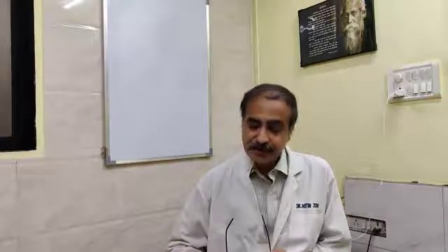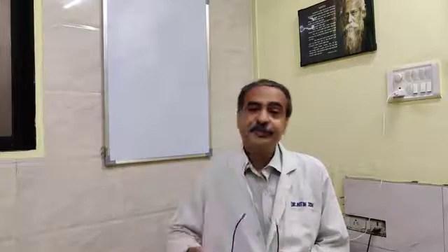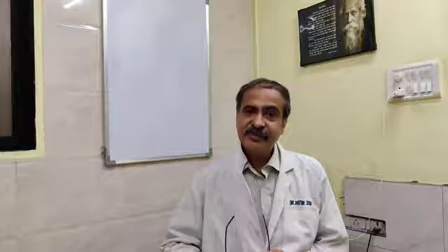Doctor, in case of complete subtrigonal perforation, what will be the finding when you see through the scope? Now, subtrigonal perforation is like a trauma, and in response to this trauma, the bundle of smooth muscle fibers which encircle the bladder neck and form the internal sphincter contract.